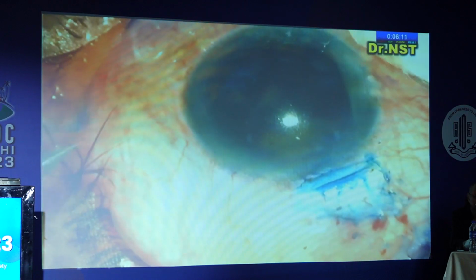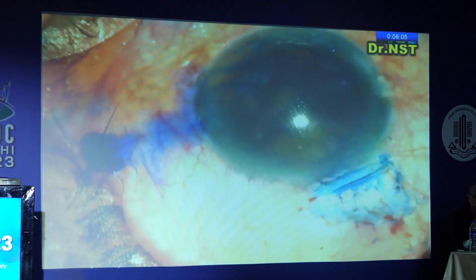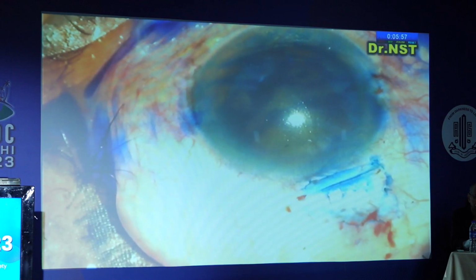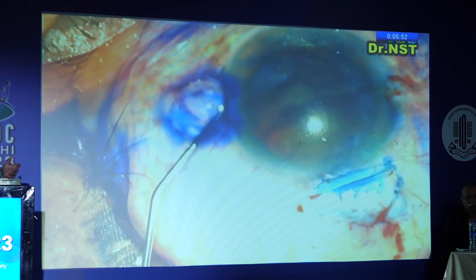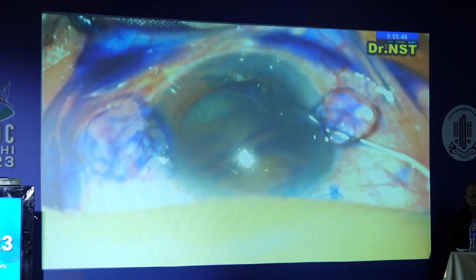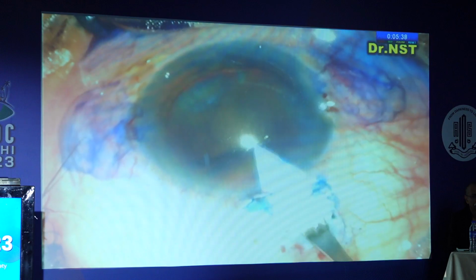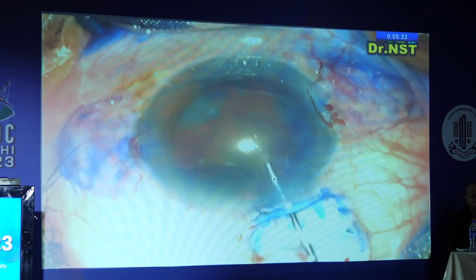And here it is the discoloration, which is very important prior to surgery, that the anterior chamber should be with one solution only. It should not be mixed with many solutions. All these things can get messed up, but we can manage. But this has happened and we have to tackle. We have to remove the bluish discoloration. And this is a very important step. You go in the entry and try to find out, and it should be 2.8 or 2.2, whatever we decide.